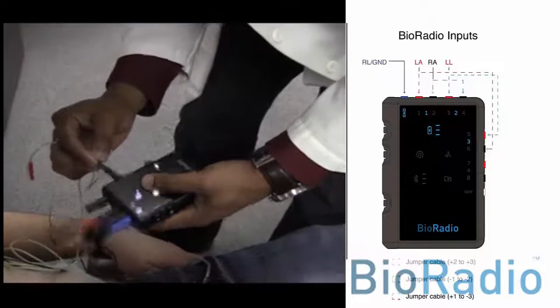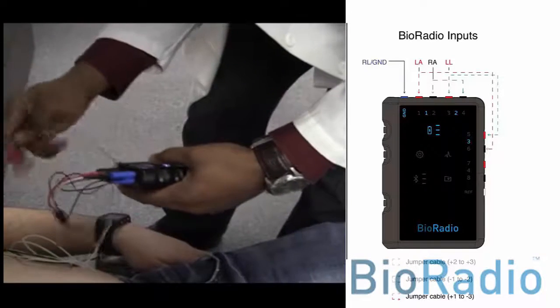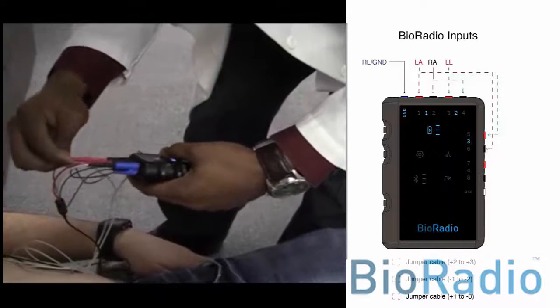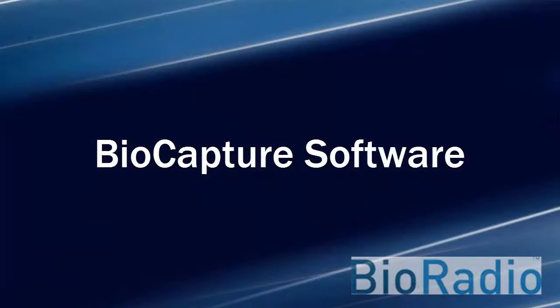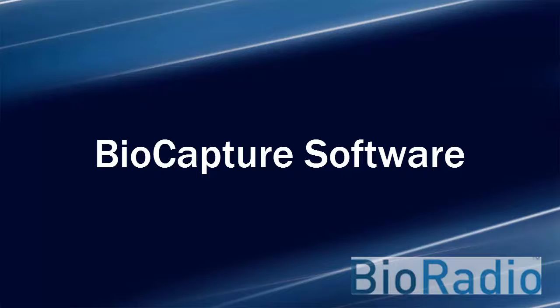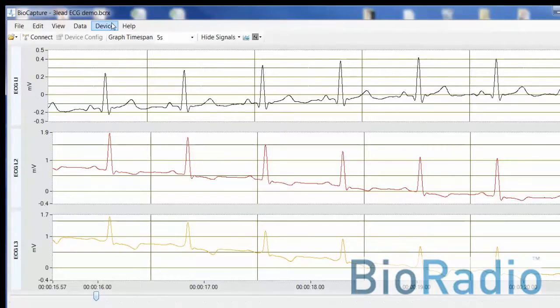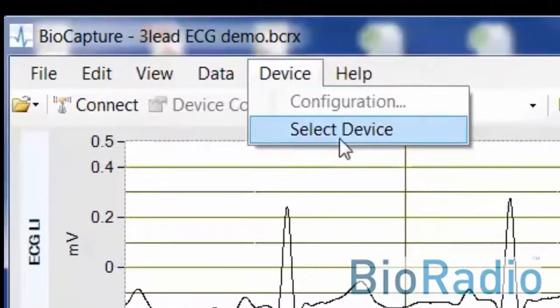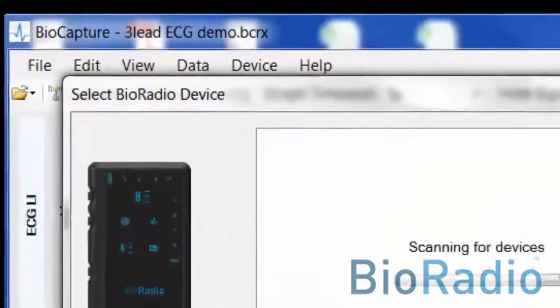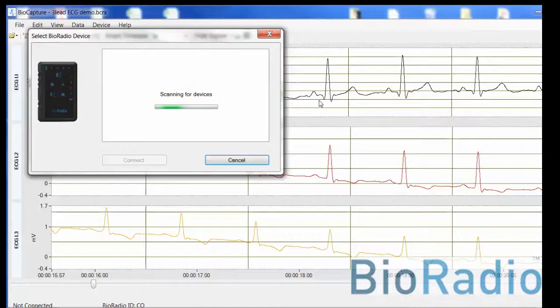Once you have set up your inputs, you can successfully proceed to the BioCapture software. To properly use the BioRadio with the BioCapture software, you will need to connect the BioRadio via a Bluetooth connection on your computer or provided by a USB dongle.